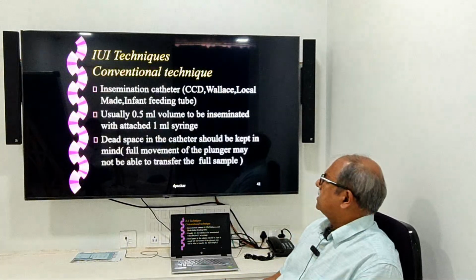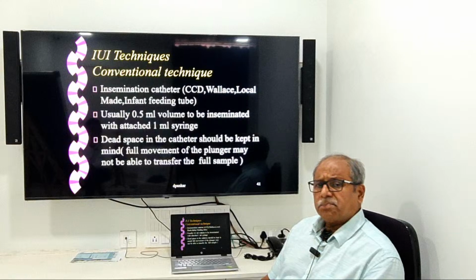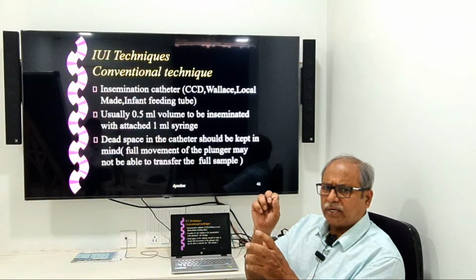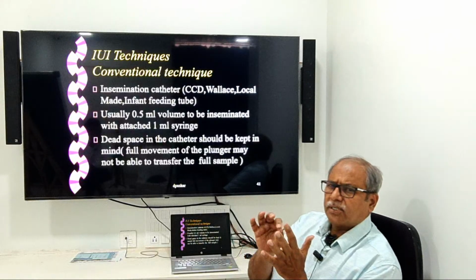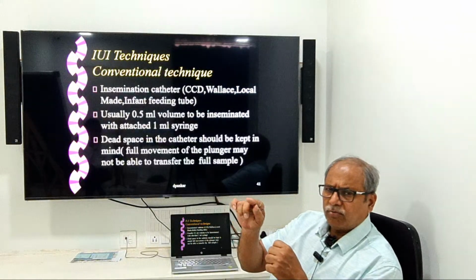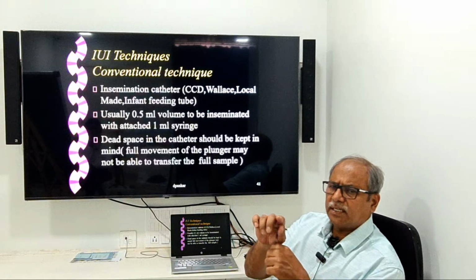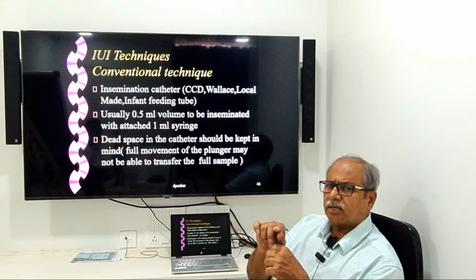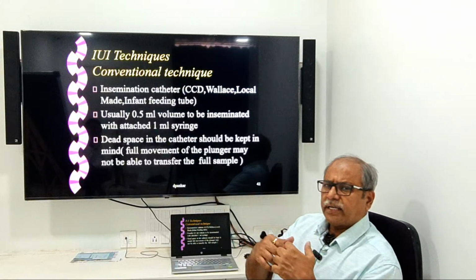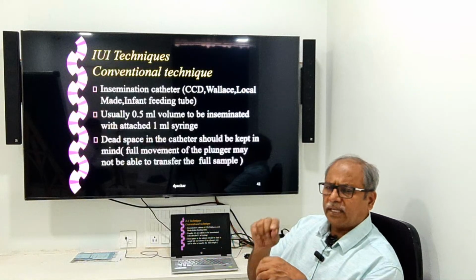What to be done with these patients for this insemination? What I do is try a simple IUI catheter, an Insular type of catheter, which has a small tip, with the syringe. If it goes inside the cervix, it is better to go to the internal os. If it crosses the internal os easily, no problem. But if it abuts the internal os and doesn't go inside the uterine cavity, nowadays I use an embryo transfer catheter, which is very soft and the inner one is very thin.